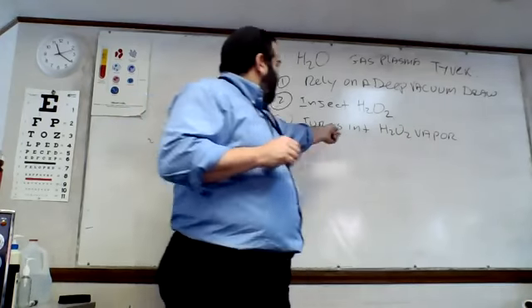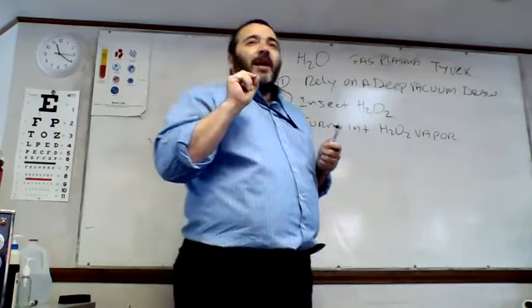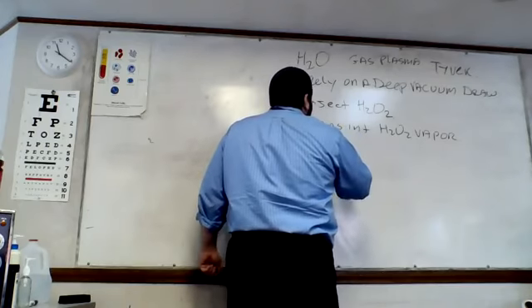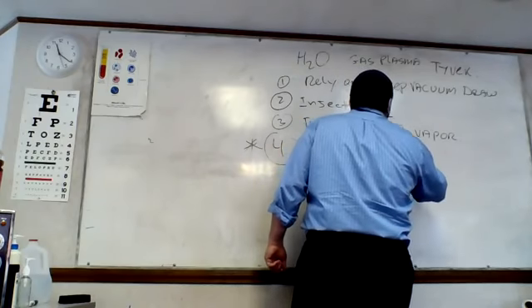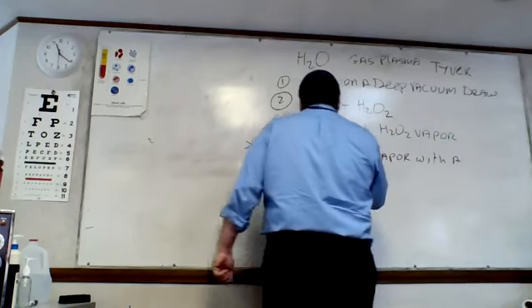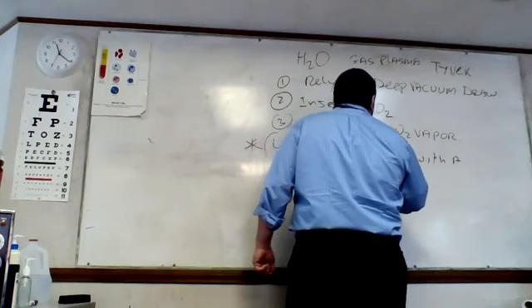After that, we zap it with a radio frequency. It's a very technical term. Zap the vapor with what they call RF for short, or radio frequency.